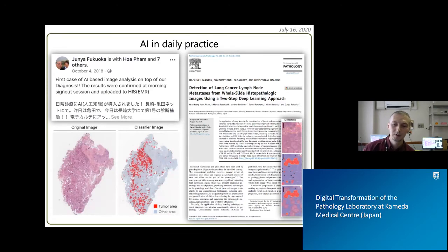Here is a good example just to show you. Our team developed AI algorithms for detecting lymph node metastasis of lung cancer and also assessing tumor cellularity in lung biopsies. It's important for sending specimens for molecular testing. The former study was published last year in the prestigious American Journal of Pathology, and I may say that more than 10 studies are in progress at the moment or have been presented at major conferences, such as USCAP, the Pulmonary Pathology Meeting, or the Digital Pathology Association.